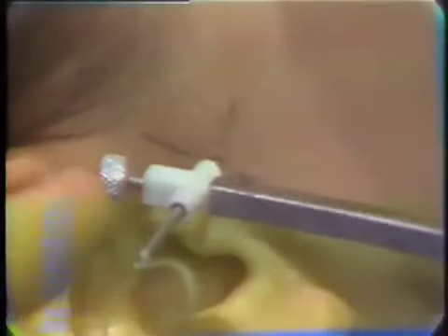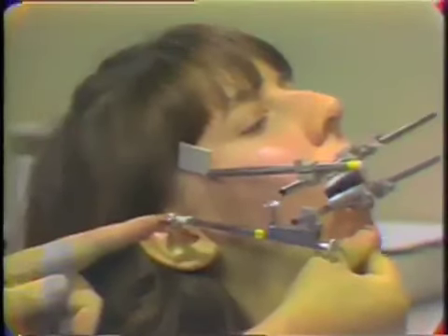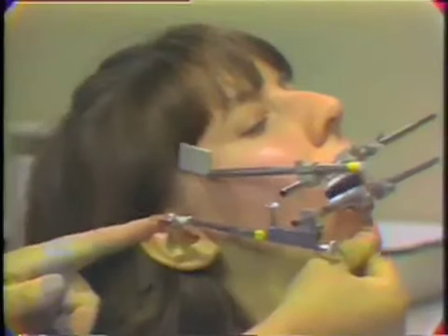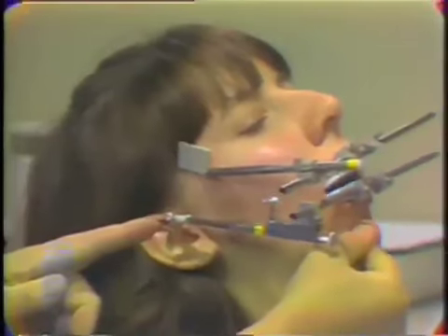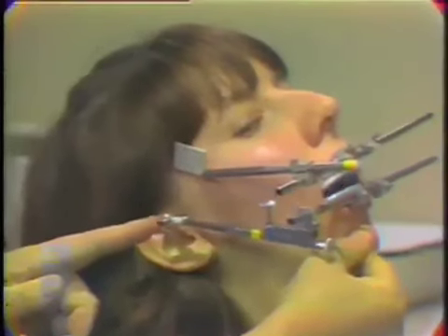So what we would want to do now is to adjust the position of that stylus, which is arcing, until it reaches a position to where it rotates. When we find this position where the stylus just completely rotates, this would be the hinge axis position.